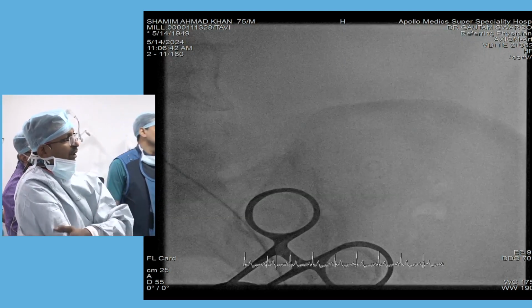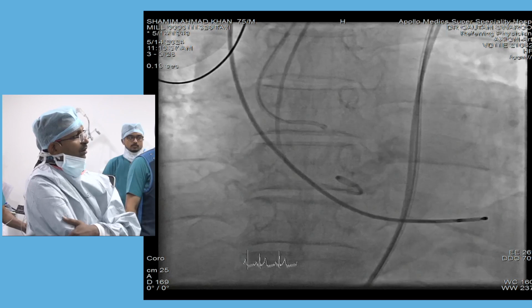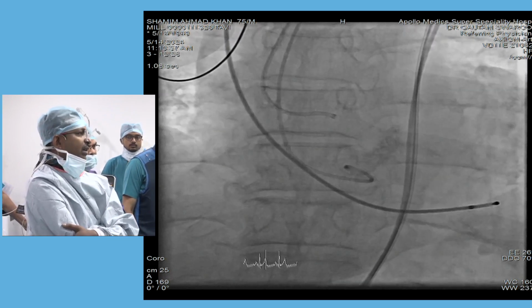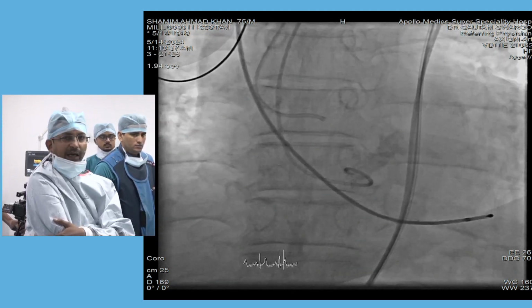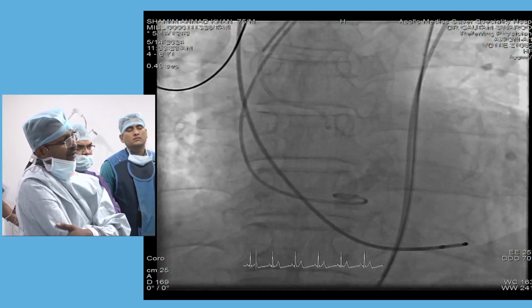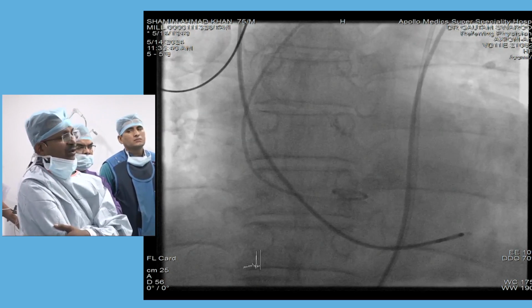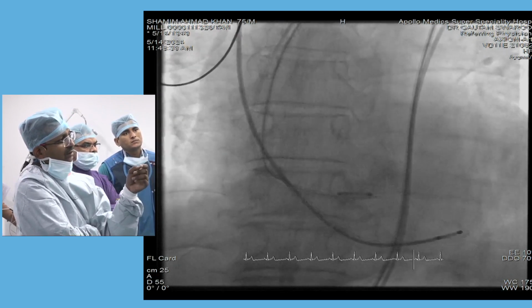So we took the pigtail catheter and we placed the pigtail catheter into the non-coronary cusp, as you can appreciate on this. Then we take the AL1 catheter and we try to cross from the lateral border of the pigtail catheter. That was the plan. Again, as per prediction, it was basically a tough crossing. We took the Teflon wire, then exchanged with the Terumo exchange length wire. Then we took the AL2 catheter. Then again we have tried with the. Can you move it? Next, please.